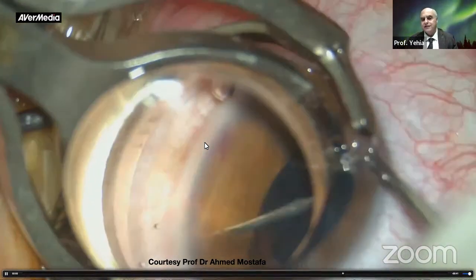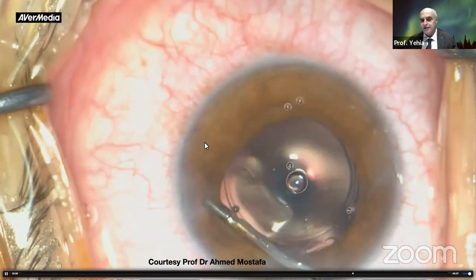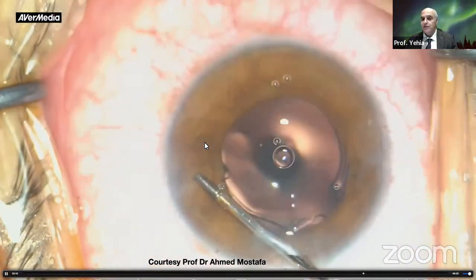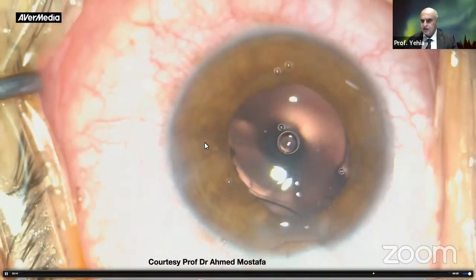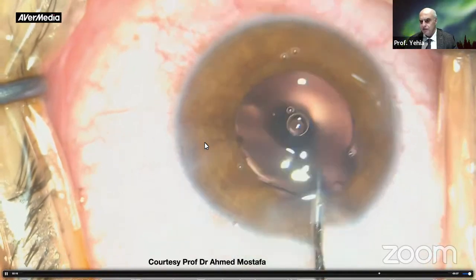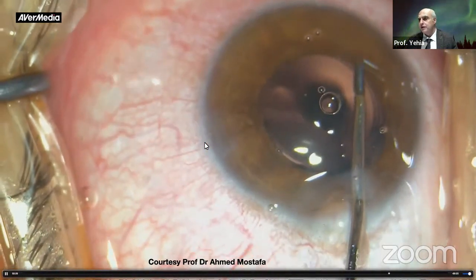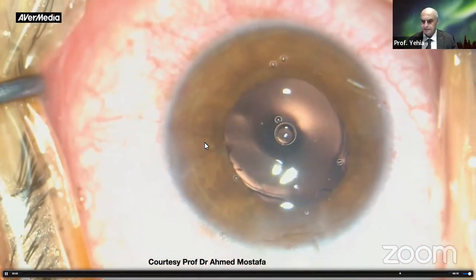You go 360 degrees. And again, this pulling of the iris to stretch it and open the angle is very useful and to help the pupil to get smaller. This stretching maneuver is very useful. You can use the microforceps or even the capsulorhexis forceps, regular capsulorhexis forceps, you can do this.